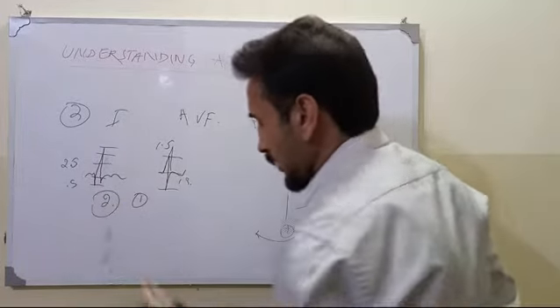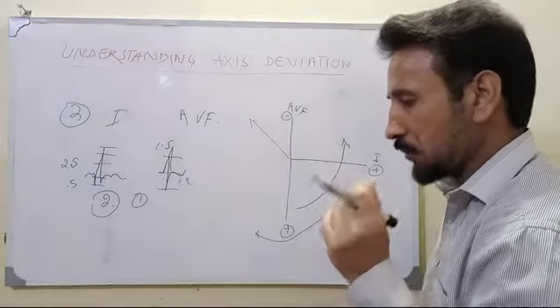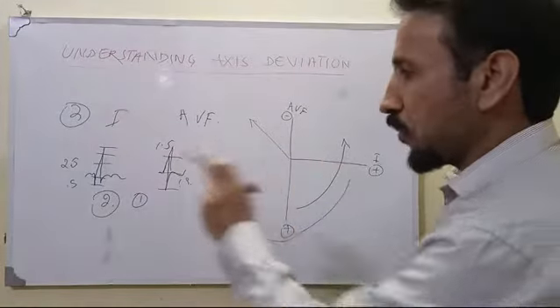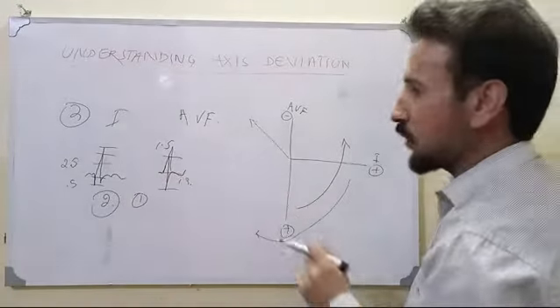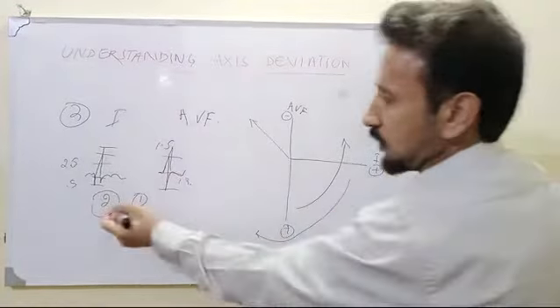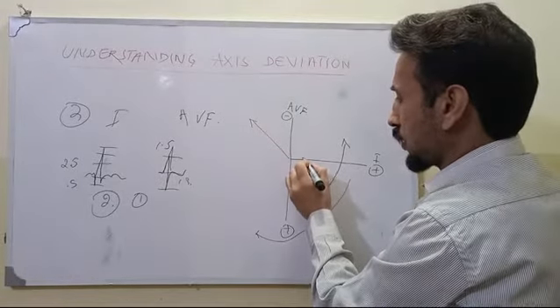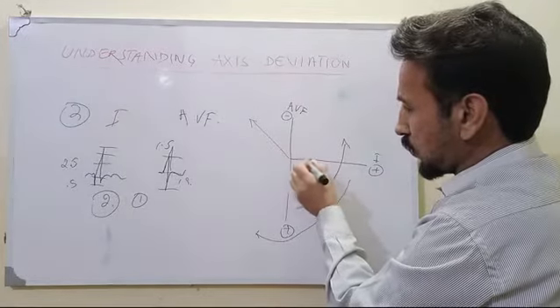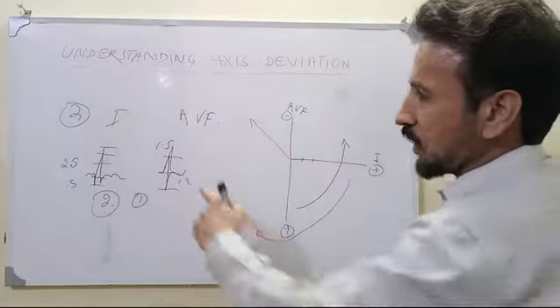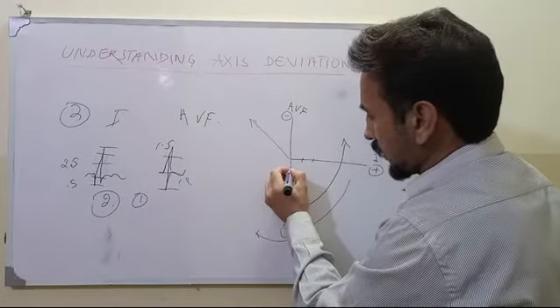Now just imagine that you have taken a calibration and you plot these net big squares on the relevant leads. This is 2 and it is in the upward direction, so it needs to be plotted on the positive pole, 1 and 2 from the 0. In AVF it is also upward but it is 1, so it lies here.